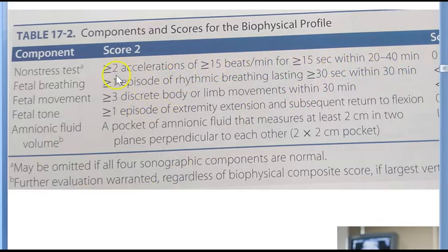If this is the NST, you check the fetal heart rate. In cardiotocography you also check uterine contractions from 0 to 100. In the example shown, there is no variation in the heart rate and no accelerations — this is a non-reactive non-stress test, which is not good. On the bottom part you can see uterine contractions. This leads us to the question of what stress actually means.